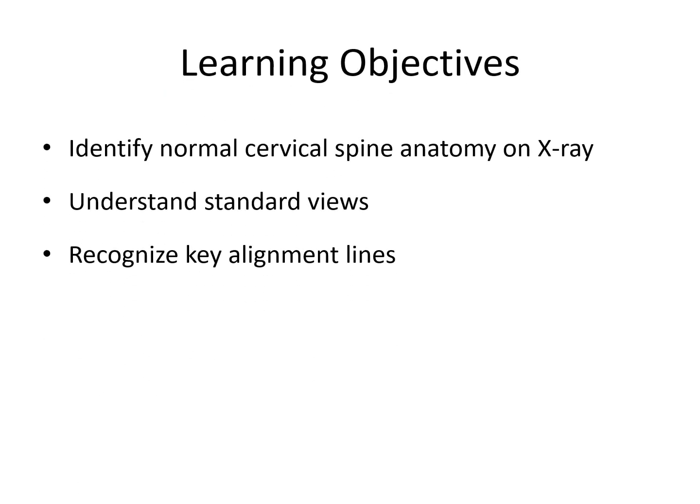learning objectives. The learning objectives of this video are to identify normal cervical spine anatomy on X-ray, understand standard views, and recognize key alignments or key lines of the cervical spine.